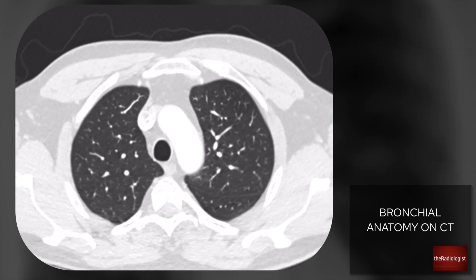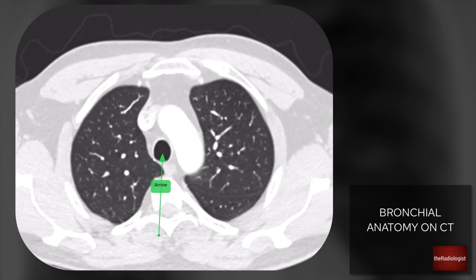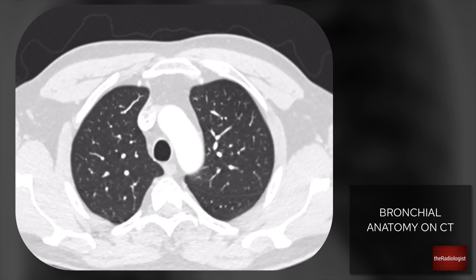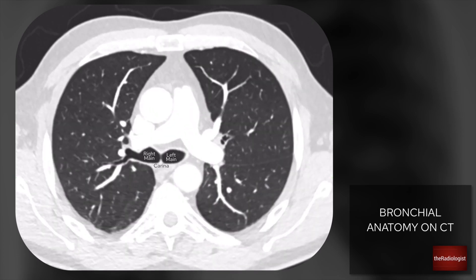Firstly, we can see this black structure in the middle is the trachea. I've flipped it onto lung windows here - that's the best way to look at the airways. This in the middle is your trachea. We're going to follow that down and it splits off here at the carina into right and left main bronchus.